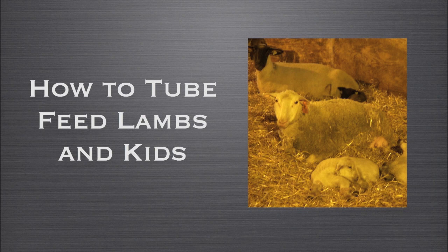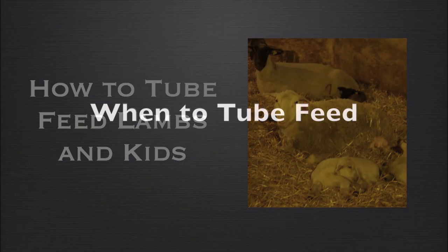Simple procedures can increase lamb crops and therefore profitability. Tube feeding is a simple process that can often save neonatal lambs.